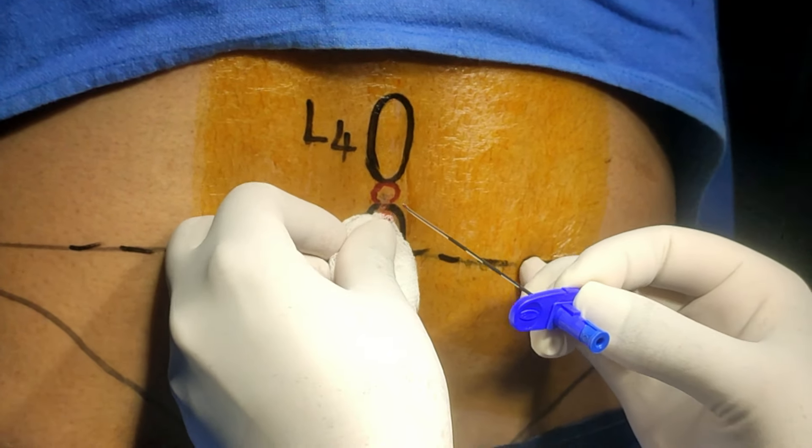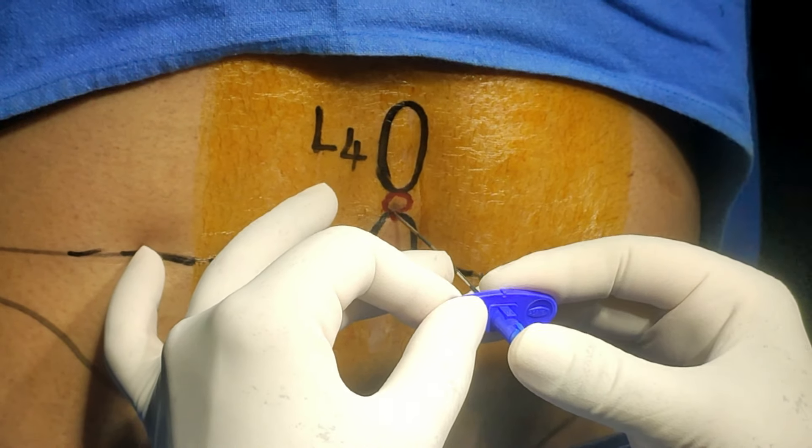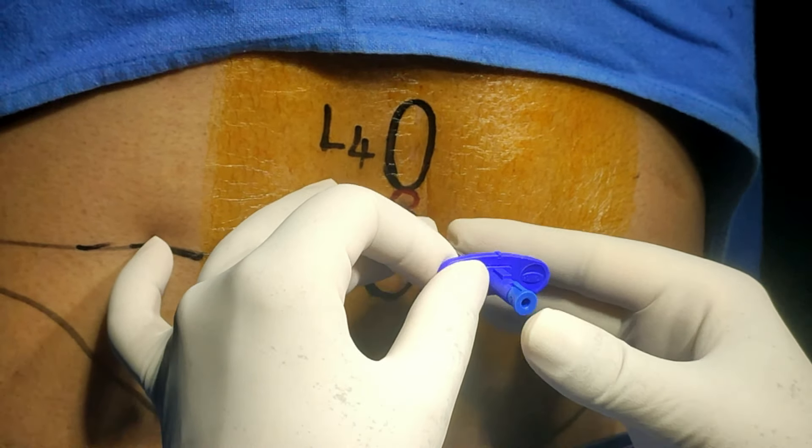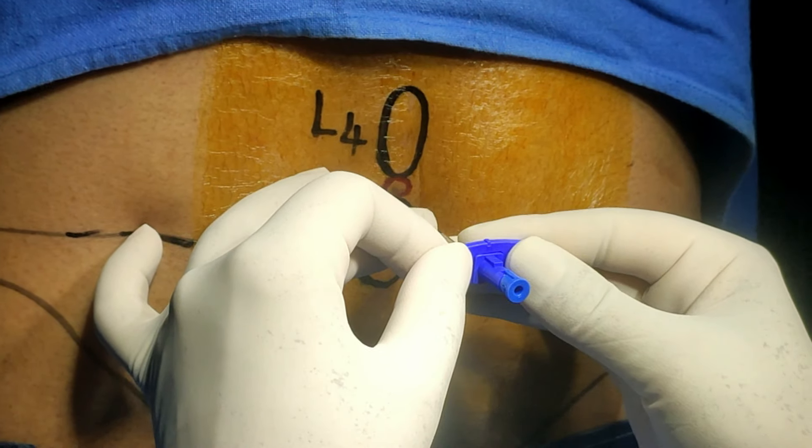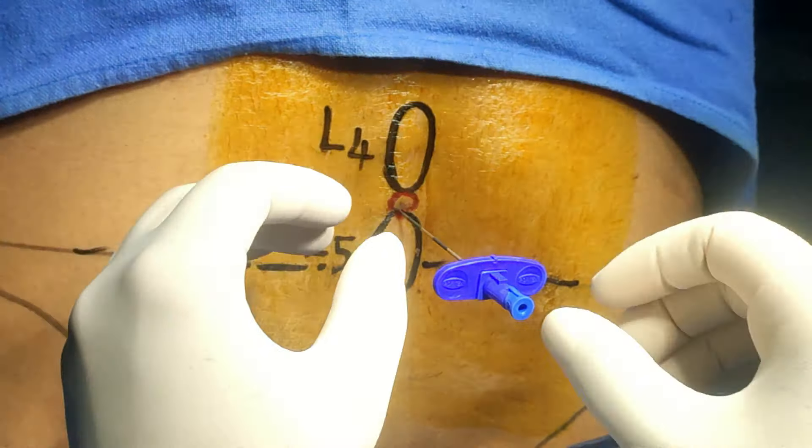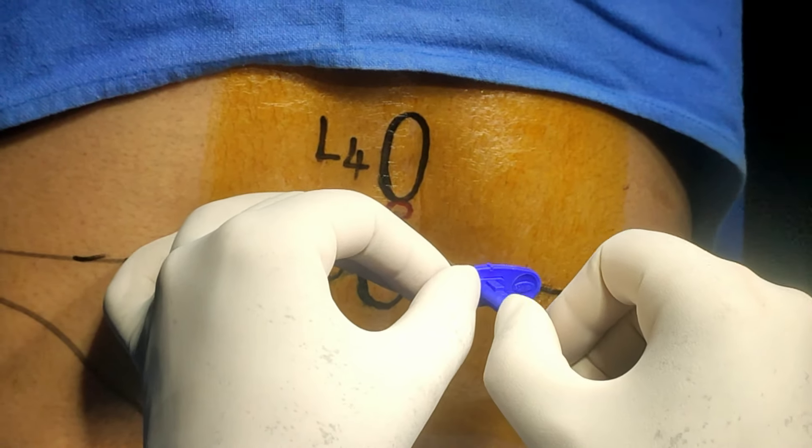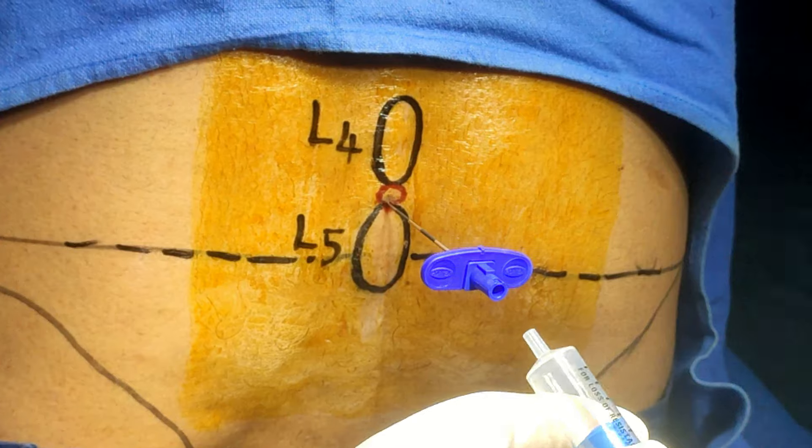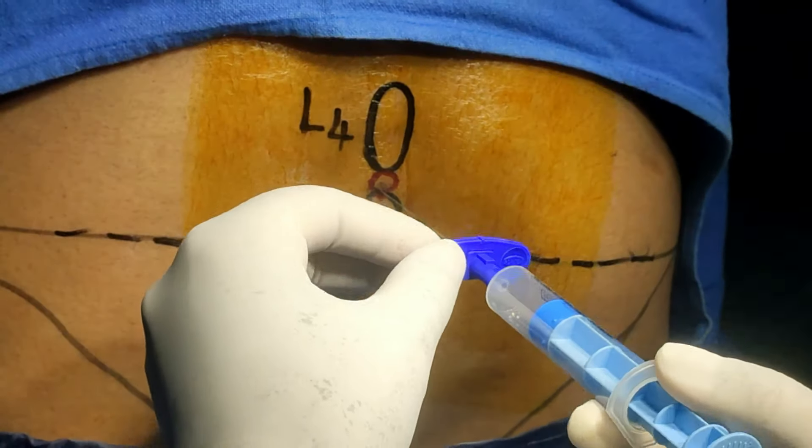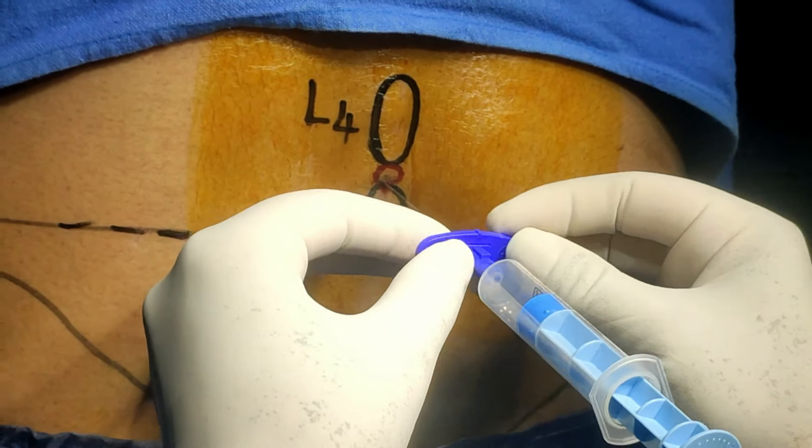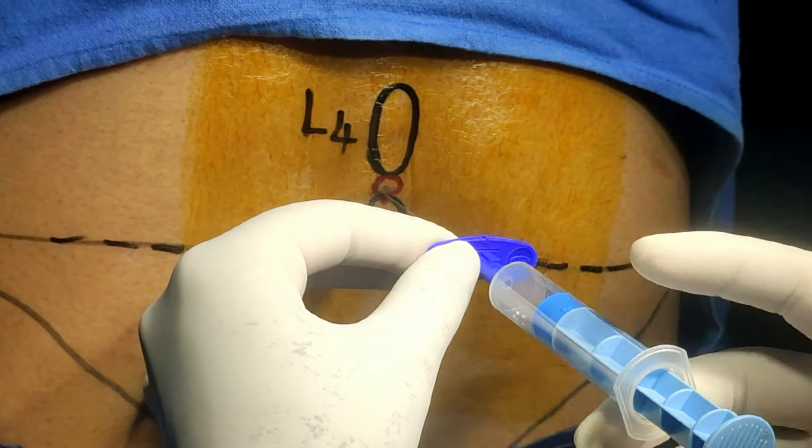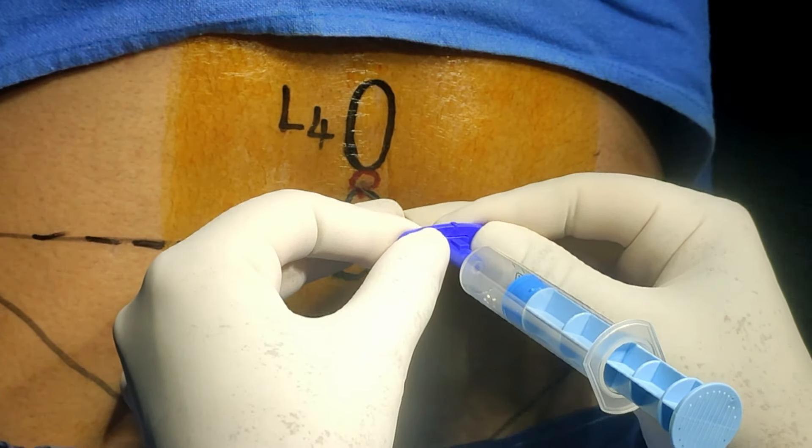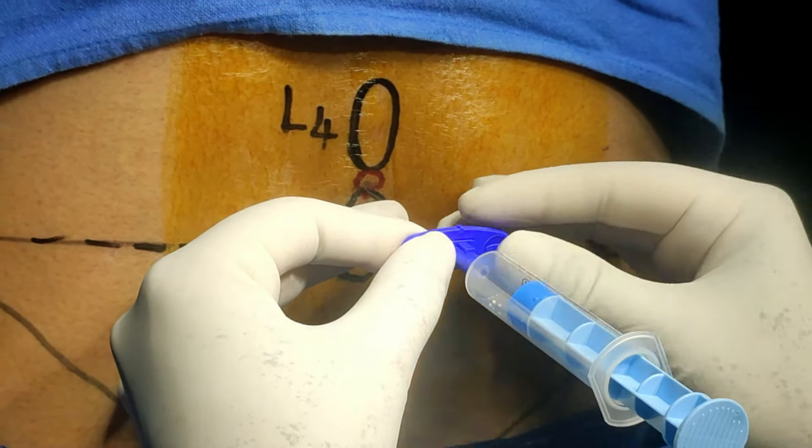From this point, insert it carefully. Yes, it has gone inside. Now remove the stylette. This is loss of resistance. Attach the syringe here and see the resistance is there. Gradually move it inside and check the resistance.